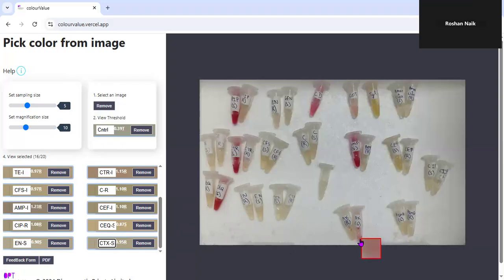Then AK: you can see the lower dose is pink, but again it drops. So AK is again an intermediate phenotype. Then we have penicillin G at last. Penicillin G is resistant. I hope it is clear.